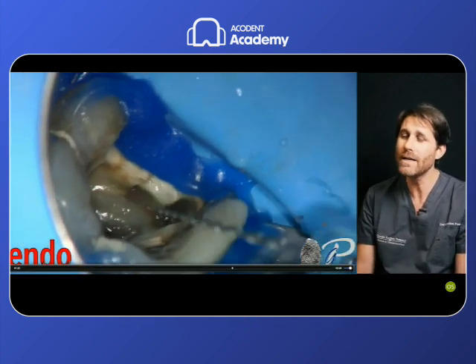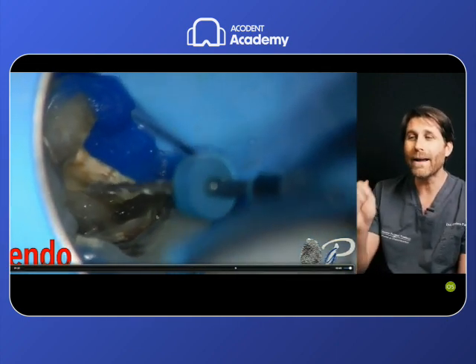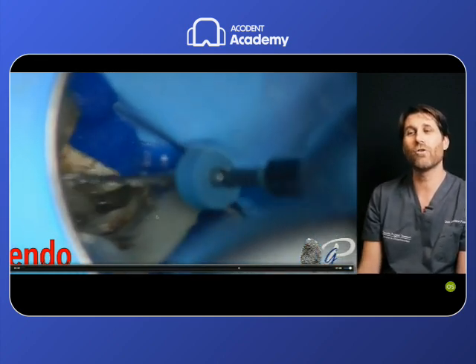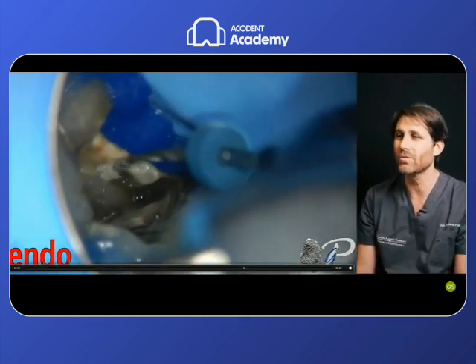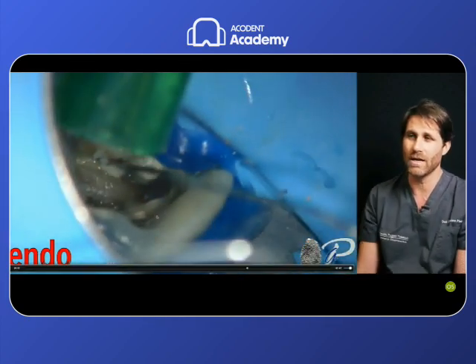And so slowly and very delicately, we advanced with a pecking up and down movement and a brushing lateral movement to remove the coronal interferences, to relocate the orifice, to make the trajectory in the coronal portion easier for the instrument to reach the apical third because of the difficulties of this root canal.